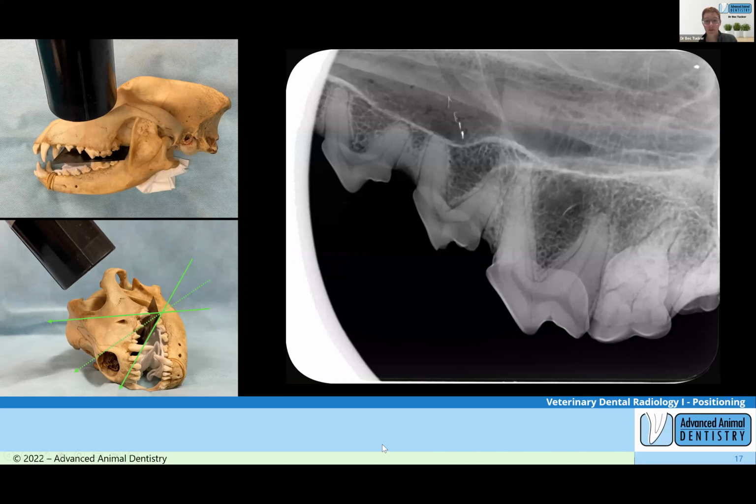Yeah, for sure. It also depends on the exposure setting. We use about 0.35 seconds, which is great. But if your collimator is a different length, or really short, or if you're pulling back from the patient further so you can expose a large area, that also impacts the exposure you need. So you've got to adjust a little based on that. Yep, distance squared, got to remember that. It really amplifies the change in distance.